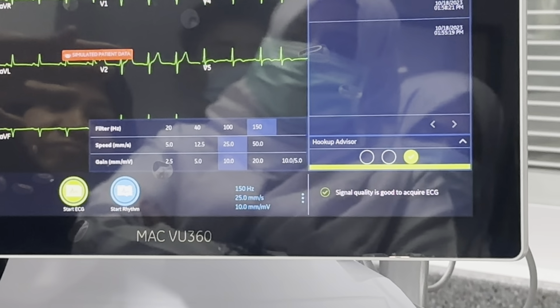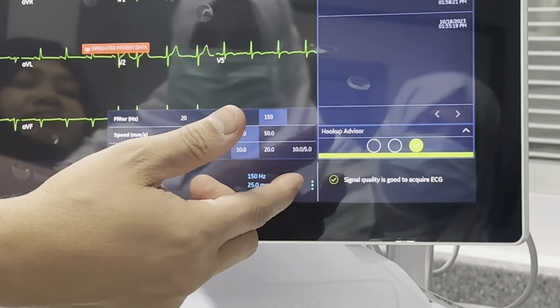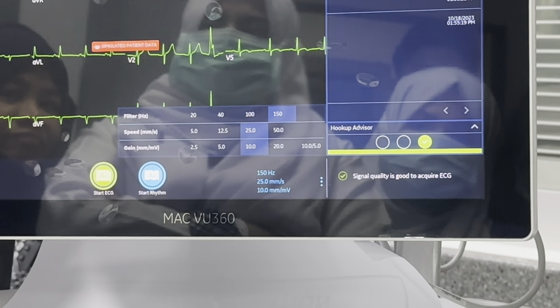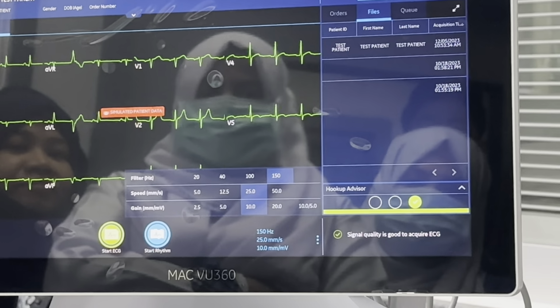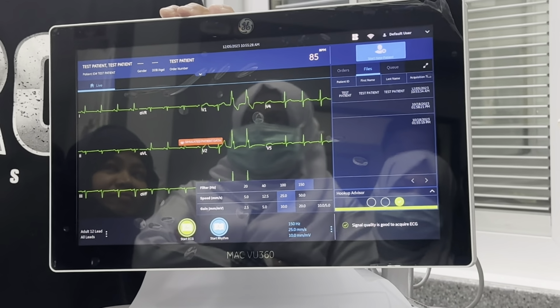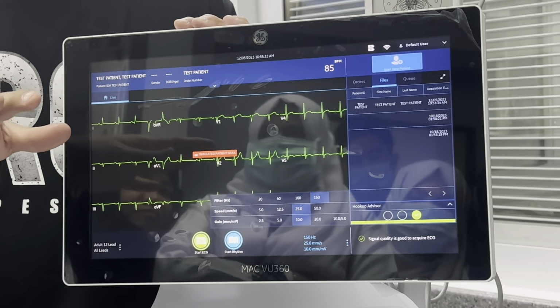If you do your workflow properly, you hooked up your patient, and you have the green indicator in here, but you still have some noise, some artifact, your report is not clean. If you print that report, your physician will push back that ECG and ask you to repeat it, because the physician is looking to recognize where the P wave started or where the QRS stands. They want to do their own measurements on that ECG. So we have to clean that report for them.